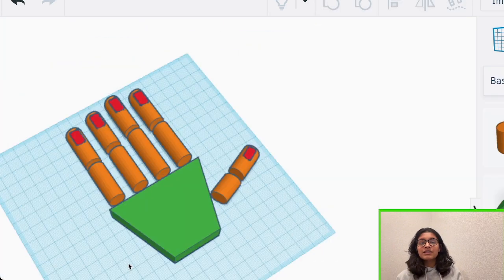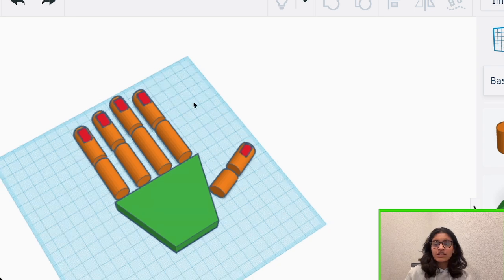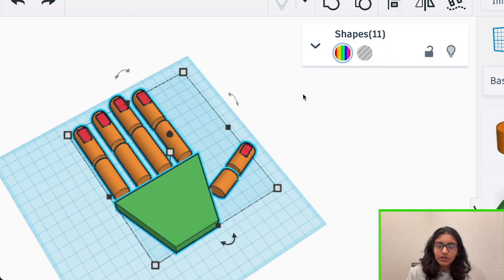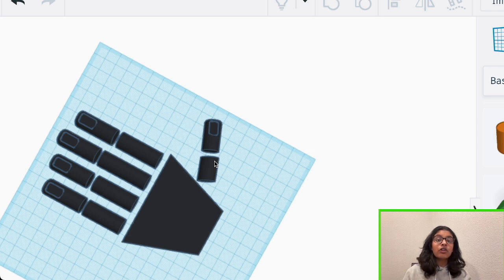Alright, so once you're done adjusting all the sizes and spacings of your fingers, you're done with the base hand model of this project. Generally, after finishing a project, I like to group it all together and make it one base color. For the gaps between each finger and the palm and fingers, those will later be filled in with the ball and socket hinge and the articulated hinge to make this prosthetic hand actually flex and move. So stay tuned in for the rest of this series to figure out how to make your prosthetic hand actually move.